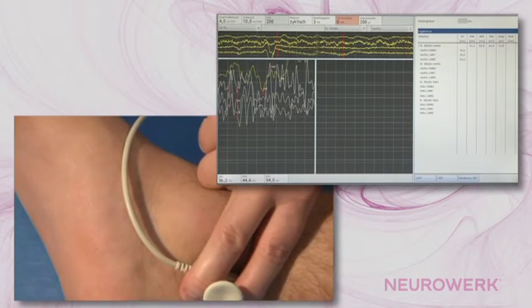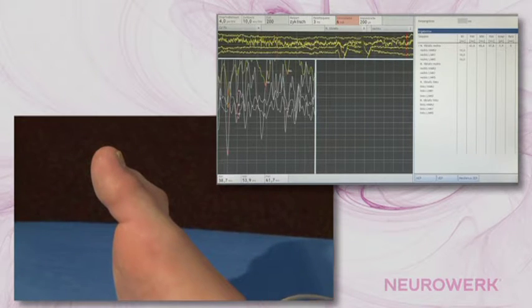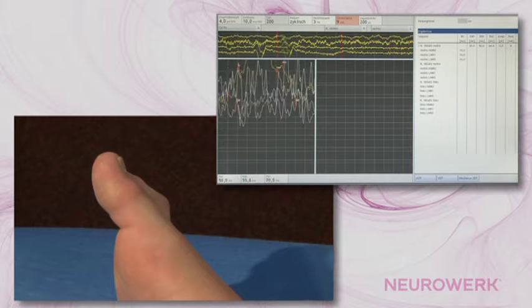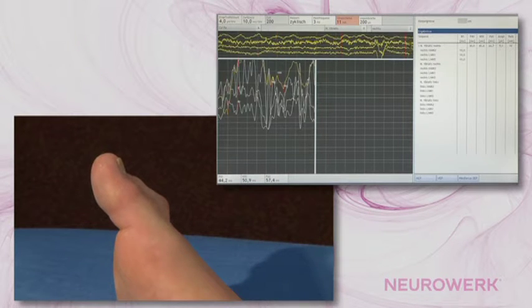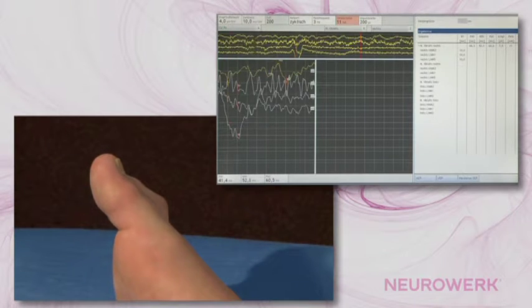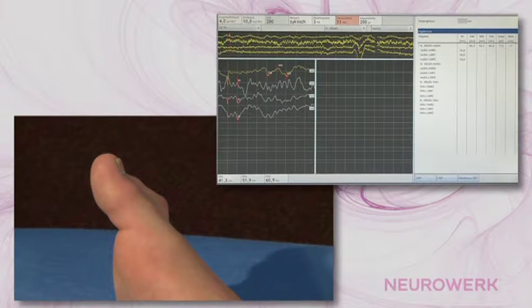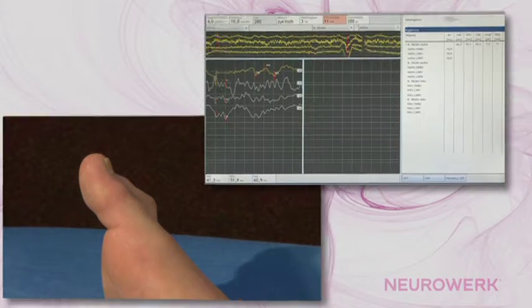The stimulation starts with low stimulus intensity and increases slowly while the stimuli are triggered cyclically. It is stimulated until a motor response can be seen on the big toe. Subsequently, the stimulus intensity is increased by a further 3 to 4 mA. Should a motor response fail to appear due to a disease, then the sensitive threshold is determined. This is the intensity at which the patient perceives the stimulation for the first time. In this case, it is necessary to stimulate at triple the sensory threshold.